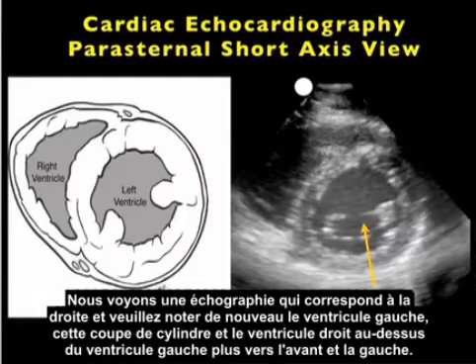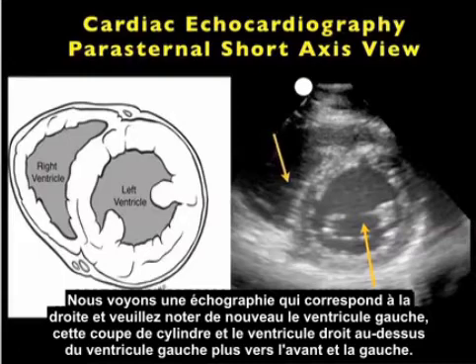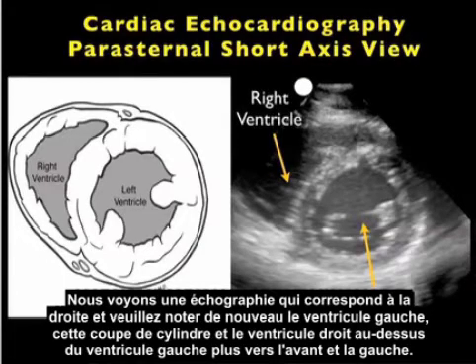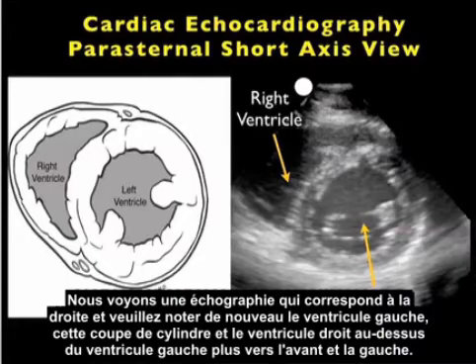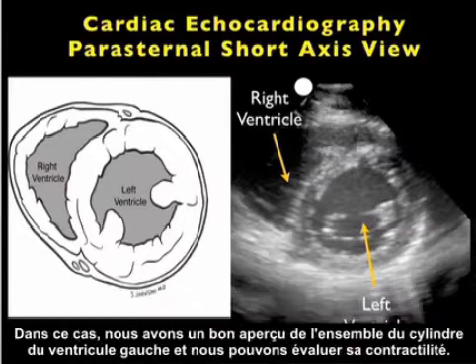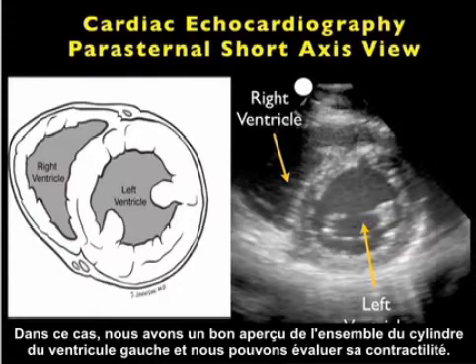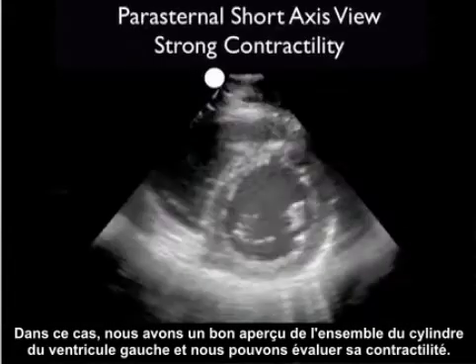The corresponding ultrasound image shows the left ventricle again as a cylinder cut in cross section, and the right ventricle above and more anteriorly to the left. In this way we get a good sense of the overall cylinder of the left ventricle and can gauge its contractility.